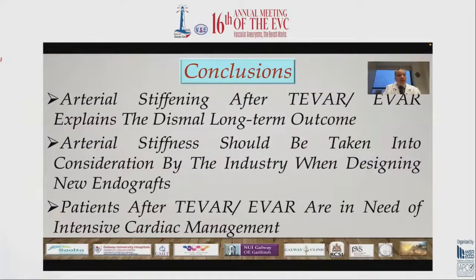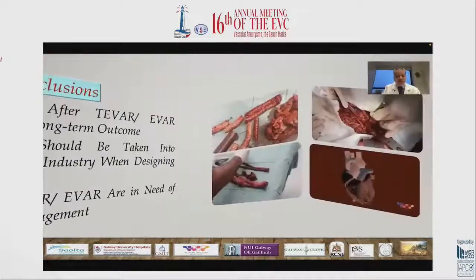Arterial stiffness after TEVAR and EVAR explains the dismal long-term outcome. Arterial stiffness should be taken into consideration by the industry when designing new endografts. Patients after TEVAR and EVAR are in need of intensive cardiac management.